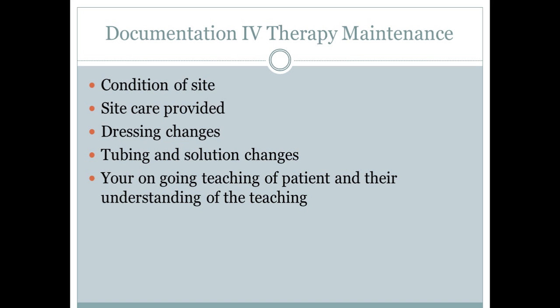But anytime that dressing gets wet or starts to roll up, or let's say a patient bumped it and that IV site is not secure, it's important that you change the dressing. You don't have to wait for the 7 days or what have you that your facility mandates. You can go ahead and change that. But definitely document that again in your nurse's notes.